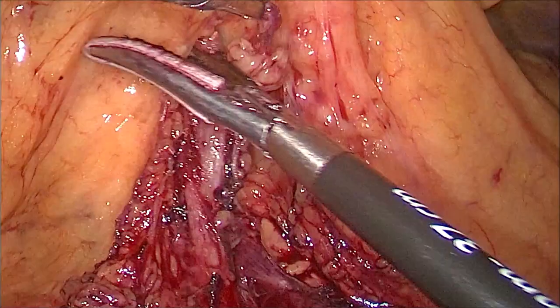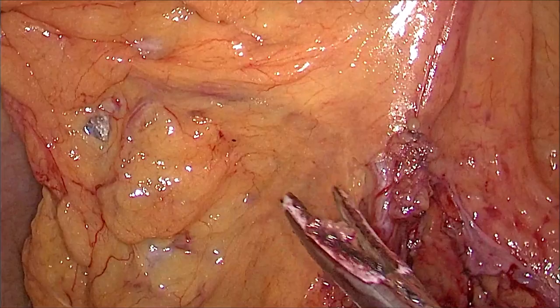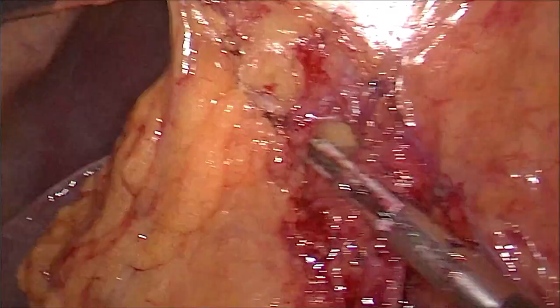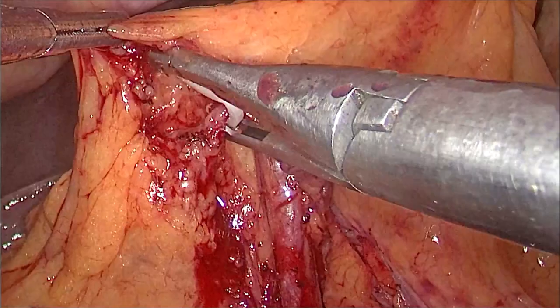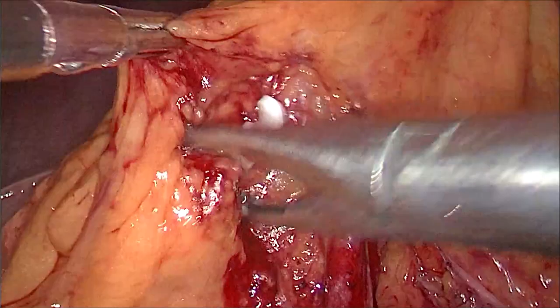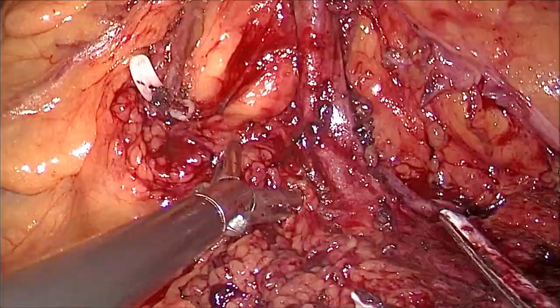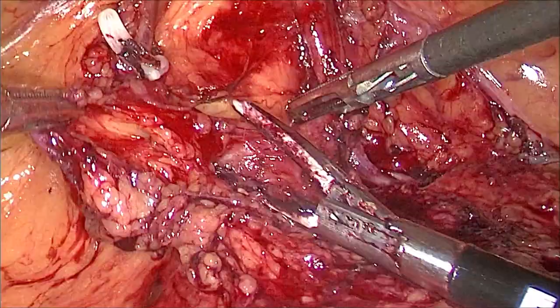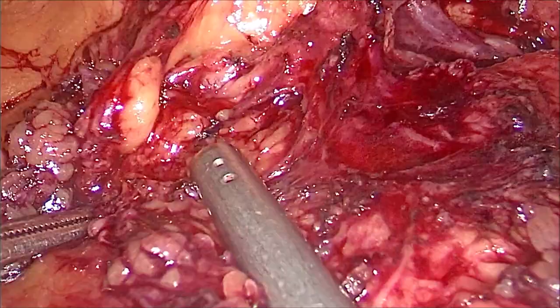The middle colic vessel is then skeletonized from below upwards. The right branch is also clearly seen and skeletonized by taking down the mesocolon with the help of a vessel sealer device. Use of vessel sealer devices like LigaSure makes dissection faster and more precise. The right branch of the middle colic vessel is clipped and then cut. We then move more proximally; the middle colic vessel is dissected towards its origin at the superior mesenteric vessel.